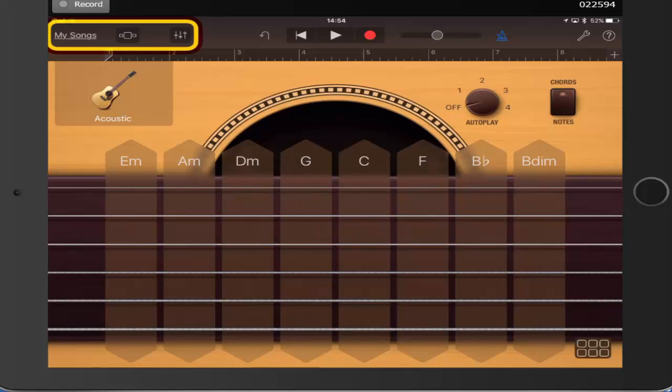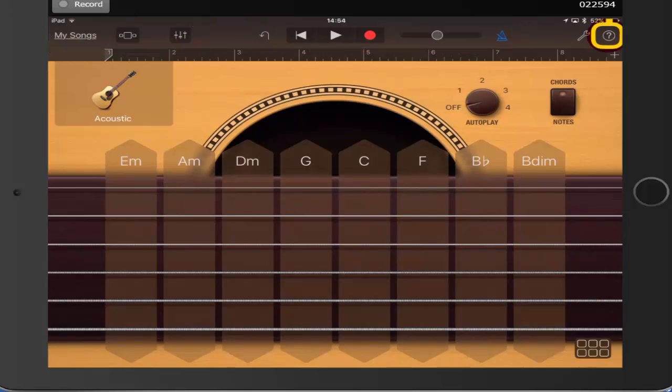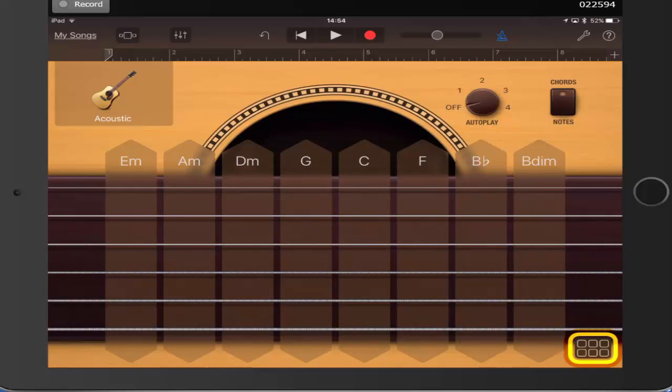Let's demonstrate that again, because what I want to do is just simply come out of this tab. So I am pressing the white button, next, next, next, next, next, and then eventually it will highlight the menu choices, orange to select, and you can see that there are 2 levels.